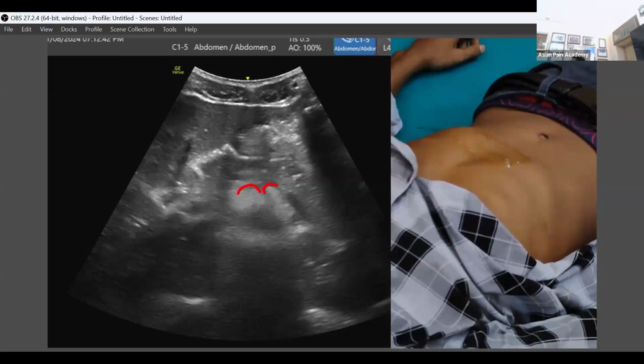From left or right side, you choose what structure you want to puncture or prefer to puncture. It's the stomach or the liver. Definitely, you have to puncture one of the organs, and then you go at the top of the seagull and then inject 20 ml of the neurolytic, usually 90% ethyl alcohol at this area. Okay. Before injecting ethyl alcohol, always remember to inject 4-5 ml of the local anesthetic, that is the lignocaine, usually 1%, followed by the injection, because neurolytic alcohol is very painful. When you are injecting, there is burning sensation. To avoid that, you should do it.